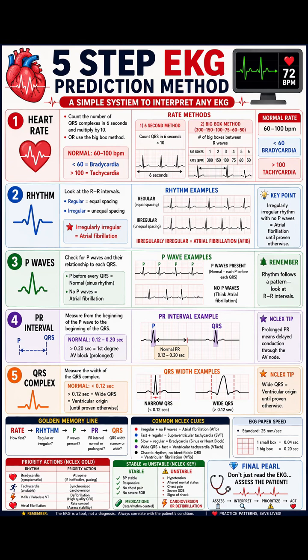Why does the QRS get elongated? Because electrical signals are not using the normal pathway. There is no organized QRS plus chaotic rhythm. Think about ventricular fibrillation or VFib. It is one of the life-threatening conditions and may require defibrillation. VFib means emergency. So whenever you see an ECG, find out if the rate is too fast or slow, and if the rhythm has a pattern, regular or irregularly irregular. Is the QRS complex narrow or wide? Wide QRS complex is danger.